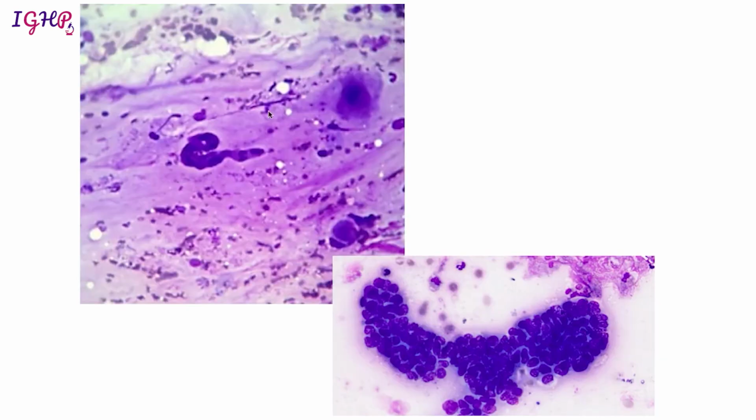Now this is again another picture. If we are getting a picture like this, herein we could see that there is abundant mucin and there are largely no definite epithelial cells, but occasional macrophages are there. So again for this we are going to call it a mucinous neoplasm, in which we are not able to differentiate it further. Now suppose from this cystic lesion we are getting abundant mucinous material in the background, and in addition we are also getting some papilloid fragments like this. Now these papilloid fragments are not the normal papilloid fragments as we could see here, as there is some nuclear hyperchromasia, there is overlapping of the nuclei.